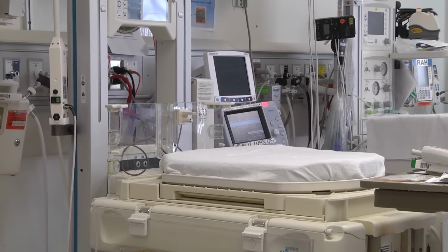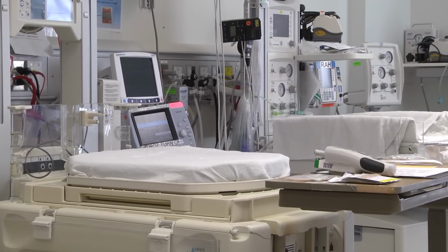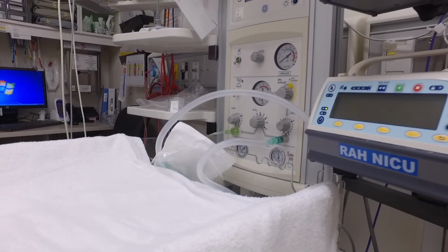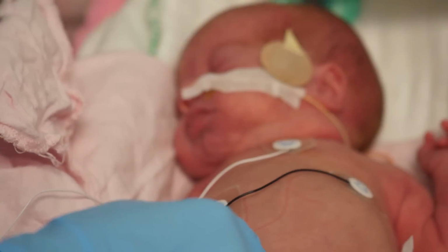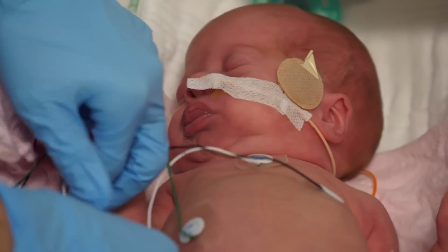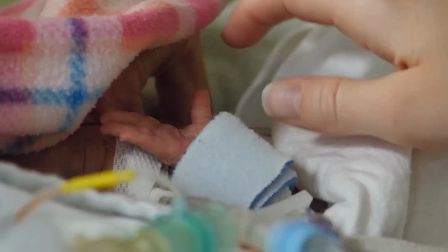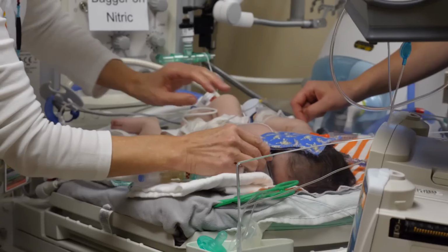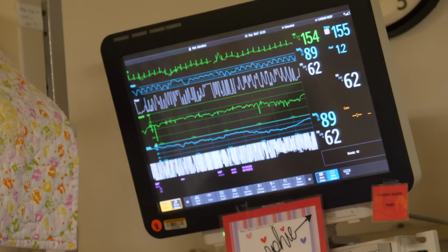After birth, your baby will be brought to a radiant warmer or incubator in the RST room. These beds will keep your baby warm. They also allow the NICU team to care for your baby from all sides. Special stickers, called leads, will be put on your baby's chest to monitor the heart and breathing rates. A special saturation or SAT probe will be put on your baby's hand to monitor oxygen levels. The time after the birth of a very small or sick infant is very busy. You will see many people caring for your baby, and you may hear alarms ringing.